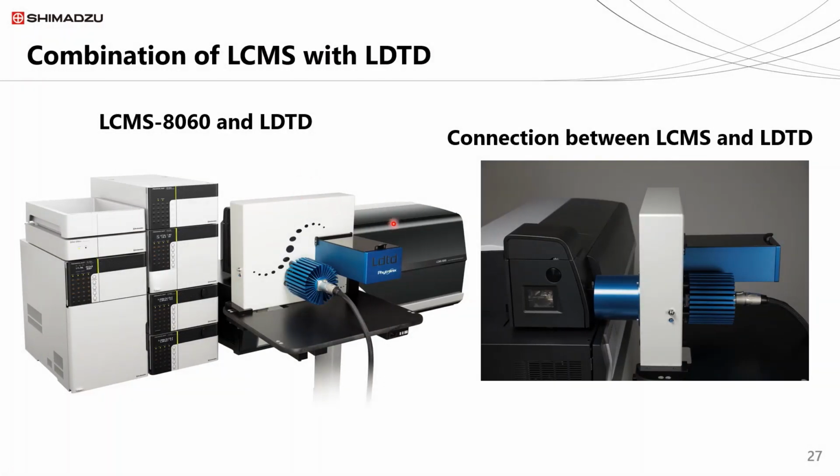This is another automation with very high throughput. LDTD is laser diode thermal desorption system. This source is a direct ionization source which gives exceptional high throughput. The speed of analysis can be as low as 4 seconds for one sample. Unlike LCMS, LDTD does not require mobile phase. So it reduces background noise during measurement. So the analysis has very high sensitivity.